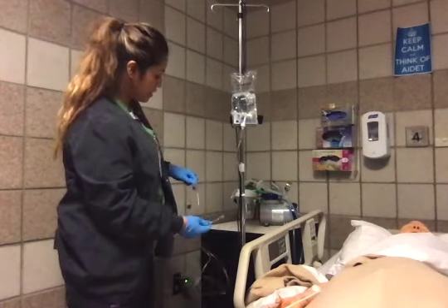And again, we're going to do our check against the MAR. We have the right medication, right dose, we have the right patient, it's the right time, and the right route. So I'm going to grab my secondary tubing, and again, it's unclamped, so I'm going to clamp it. I will remove the caps, making sure not to contaminate either end, and with one firm push and twisting motion, I will connect my secondary bag, my antibiotic, to the secondary tubing.